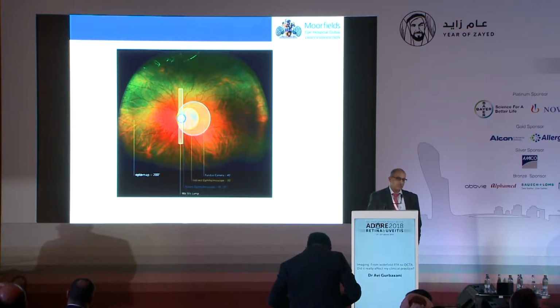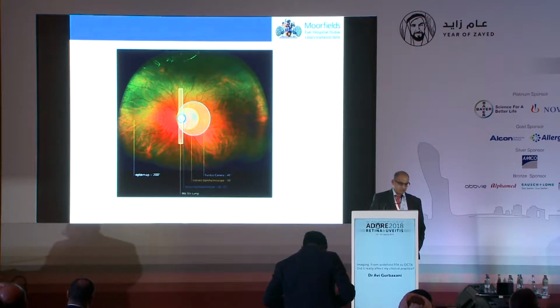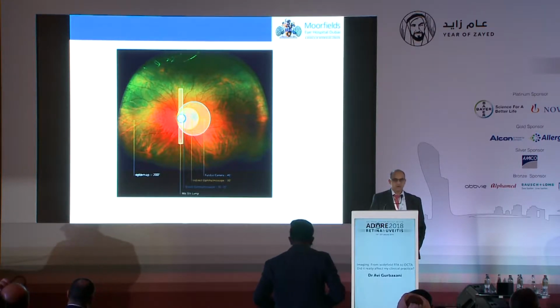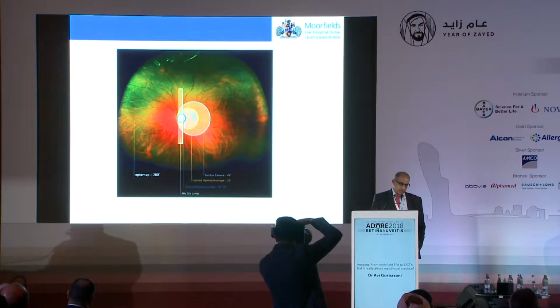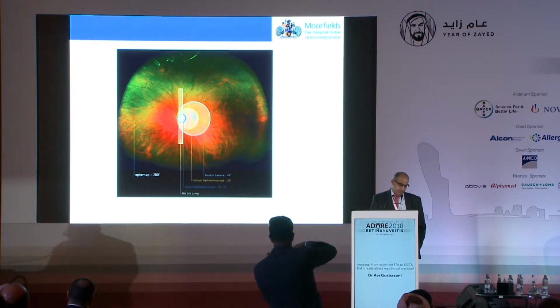You can see that the slit lamp beam and the standard photographs only show us a limited amount in the fundus, but with the Optos system, which has been around now for just under 8 years, you can see right out to the far periphery in the retina.